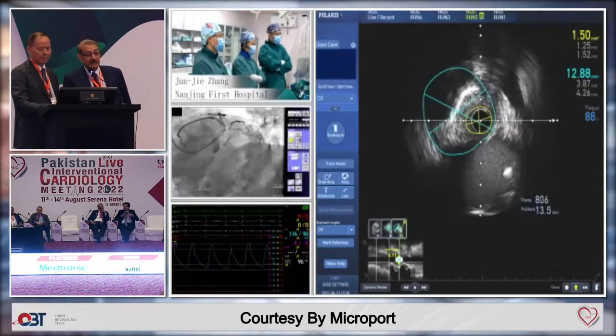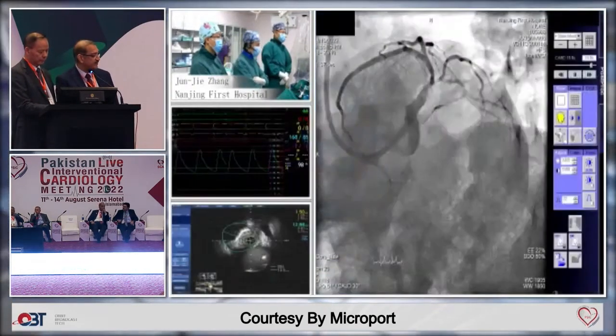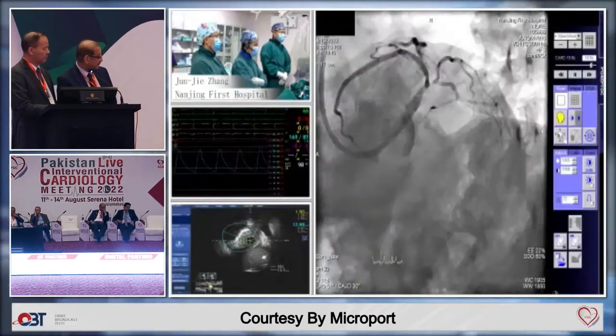Yeah, thank you. We have seen the IVUS findings now. Can we just request quick comments from the experts? Would they change the strategy or what to go for?